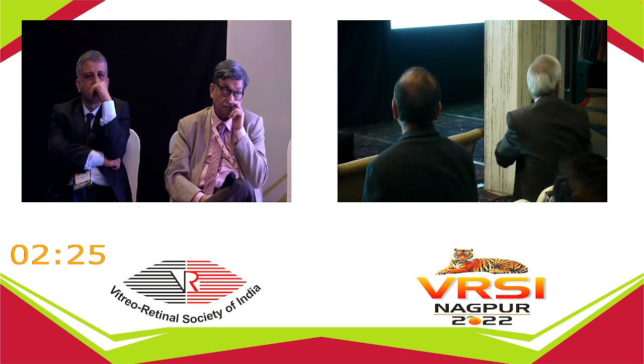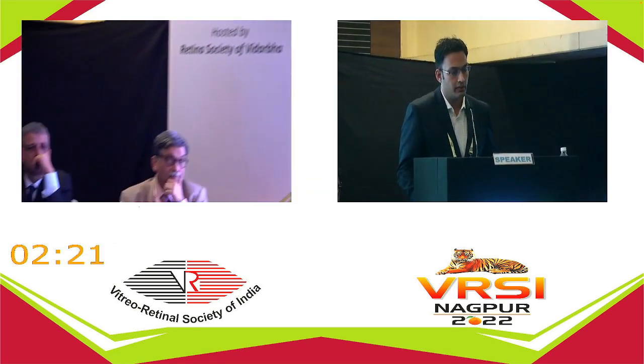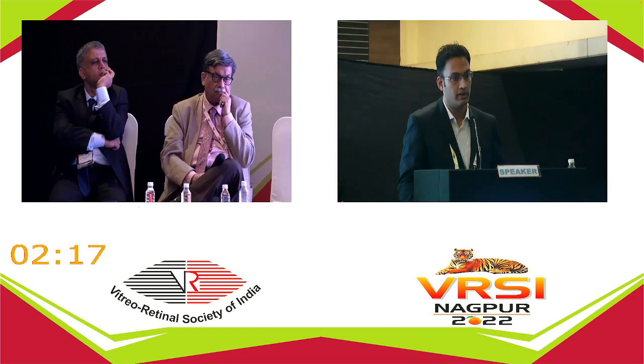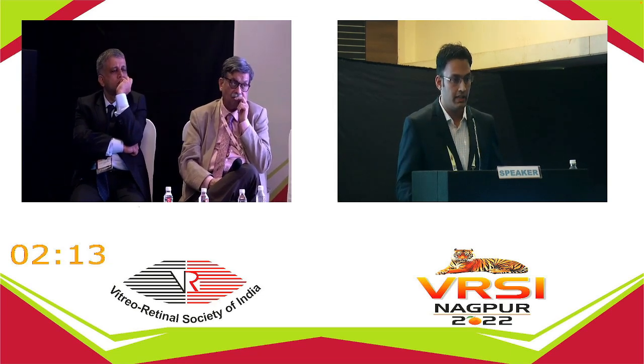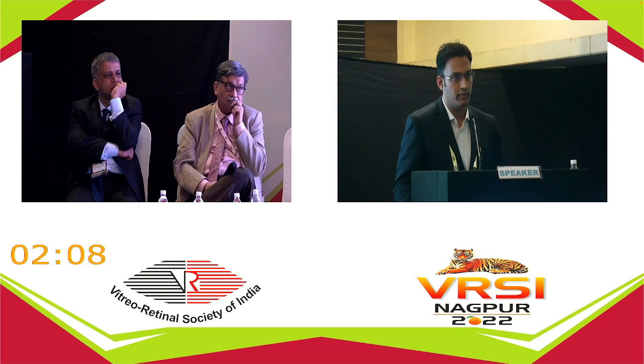Just if I can add two points. I feel there was a regma because there was an SRF that was of recent onset, because the child became dull 1 month ago. And I have experience in about 10 to 12 eyes where I've done imbrication. And this is one of my very early cases.